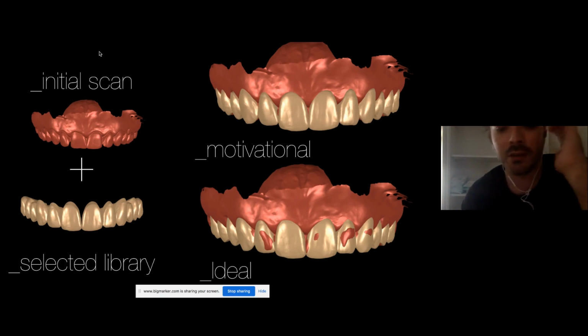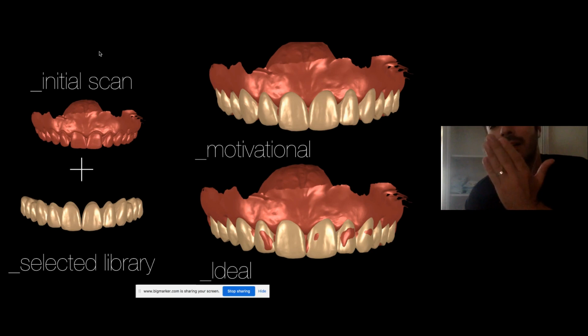Which means you always have two ways you can design, depending on where you position your morphology sagittally, because in horizontal and vertical, you will place it just like you designed it on the picture. But in terms of sagittal, how buccal that morphology will be depends on your initial situation.